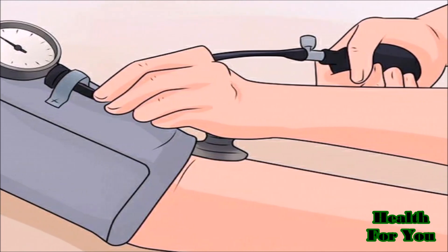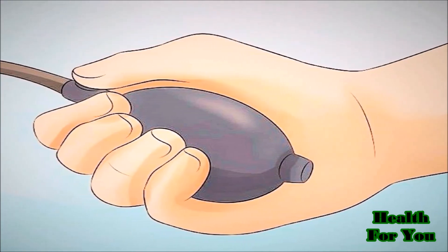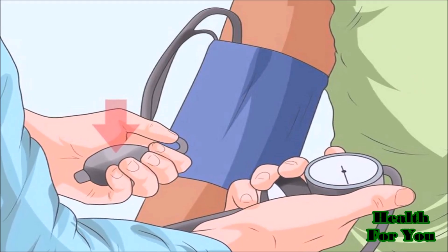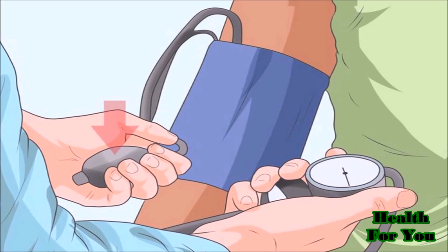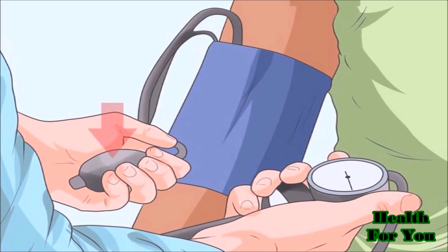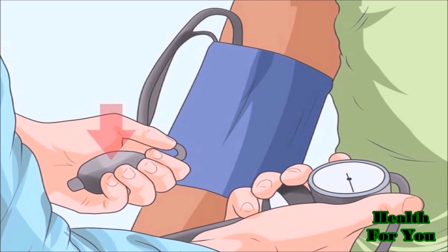You can tuck the gauge in the cuff. Hold the pump in your right hand. Now inflate the cuff, but before you start, the valve needs to be closed completely. This will ensure that no air escapes as you pump, which would produce an inaccurate reading.